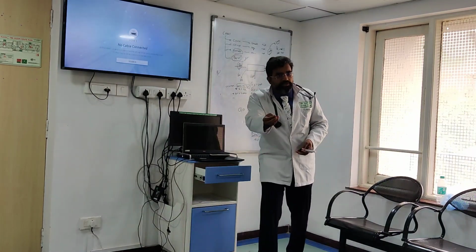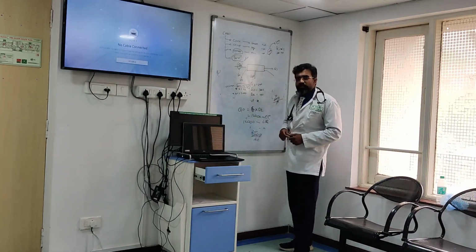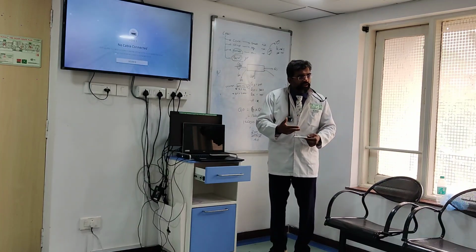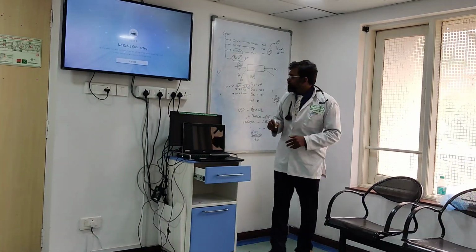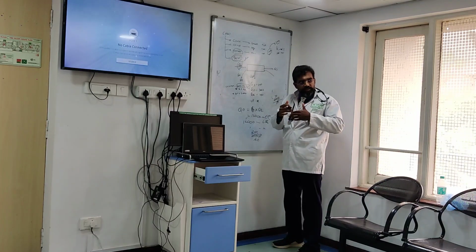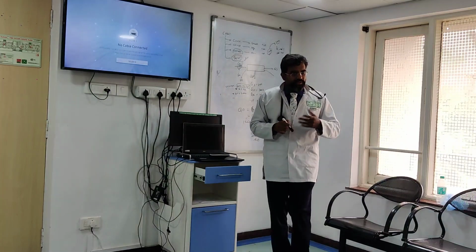मेरा dialysis is only 1,000, 2,000. Imagine a nurse taking 3,000 ml per hour. So she will be changing bags, you know, so fast. 5,000 का एक bag आता है. So within 1 hour she'll be changing this bag. From the second hour onwards she'll be quickly changing bags. Are you understanding? 3,000 ml.